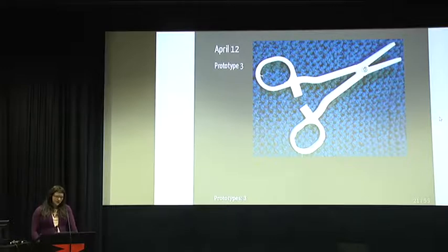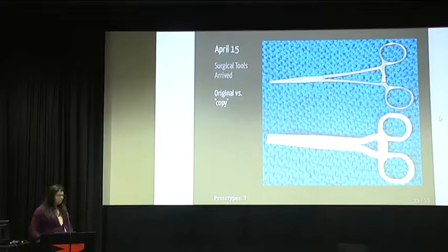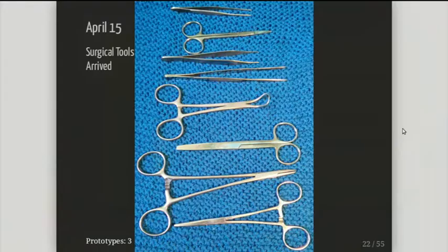Three days later, I got a nice package containing all these tools. I got some tweezers, some scissors, then again from the top there are two pairs of tweezers, then there's a towel clamp, then another pair of scissors, then a needle driver, and on the bottom the hemostat that I was working on first. I will get to the details of the other parts later. So I had a closer look at the actual hemostat made of steel.